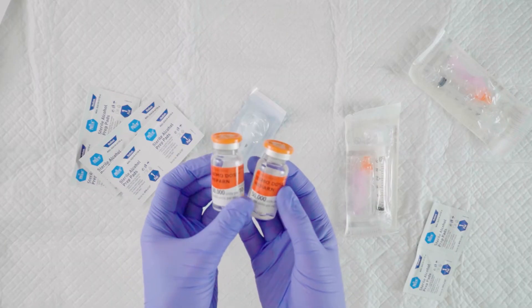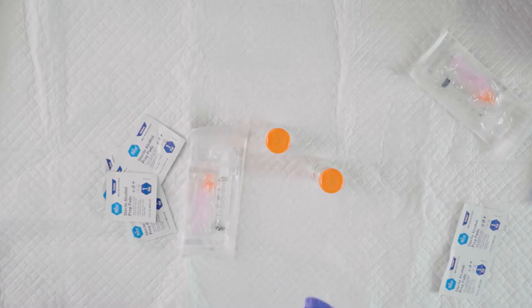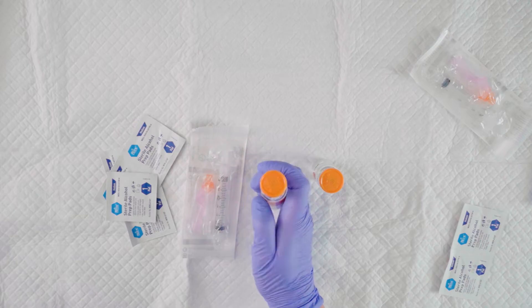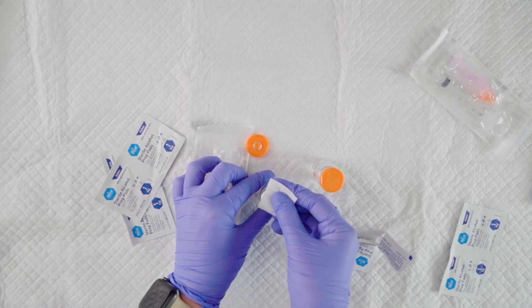You always want to check the label to verify the medication, strength, and expiration date. Now we're going to uncap our vial, then clean the vial. We do this to prevent possible contamination.